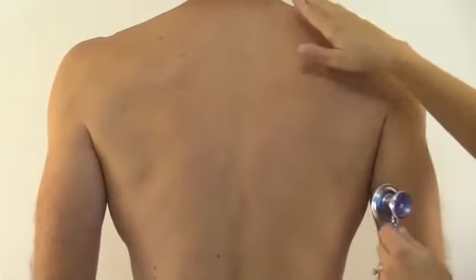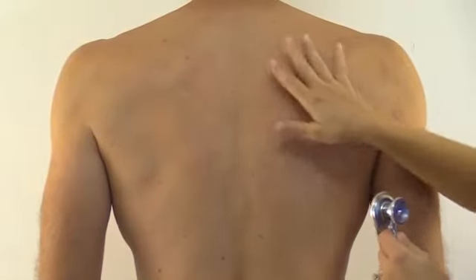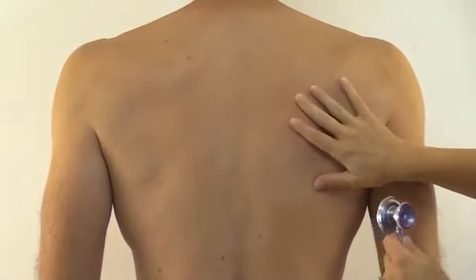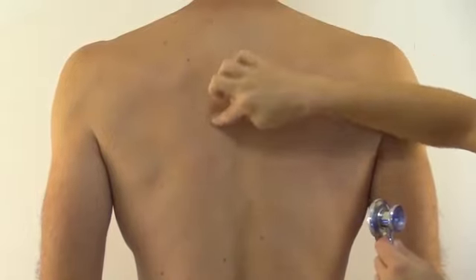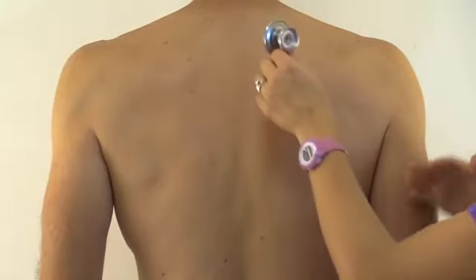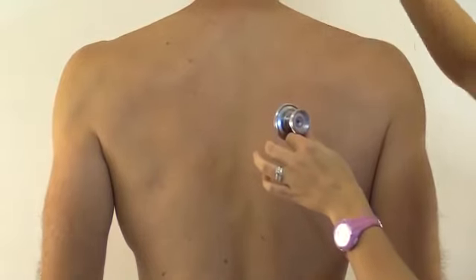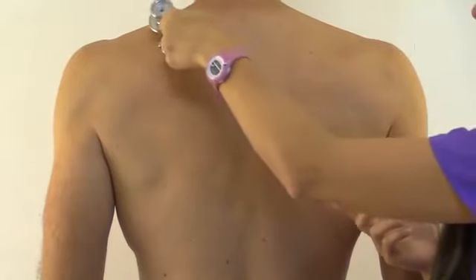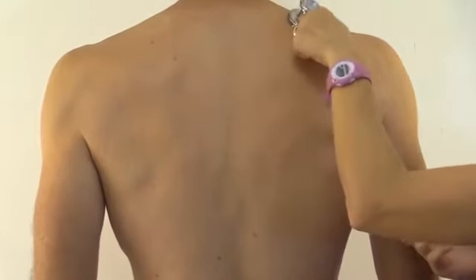Again, using the diaphragm of the stethoscope, you start listening at the apex and work your way down. One thing to keep in mind back here is the scapula. You don't want to listen over those because you won't be able to hear the sound. You listen in between the scapula and the spine. Again, we compare sides, and you can do this part at the end when you turn your patient over to look at their back, but we're going to do it now. So we're going to start here on the apex, compare sides.